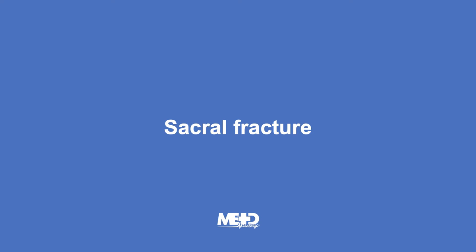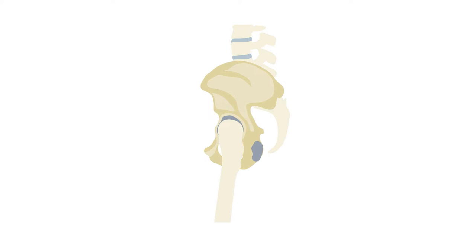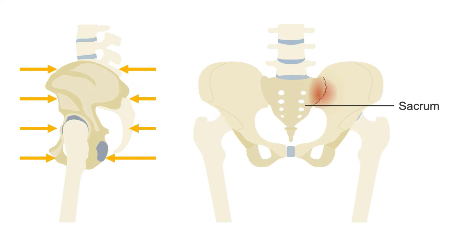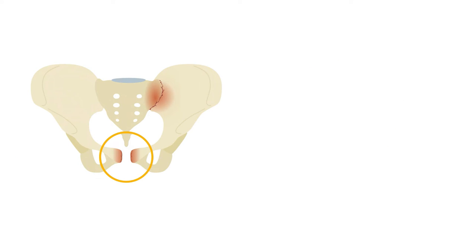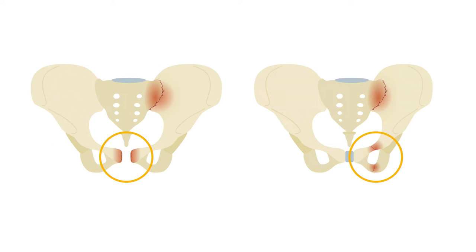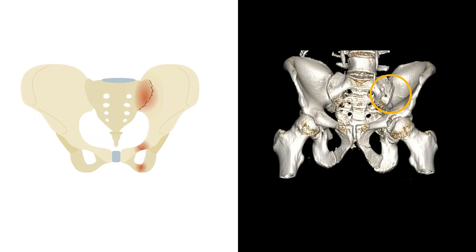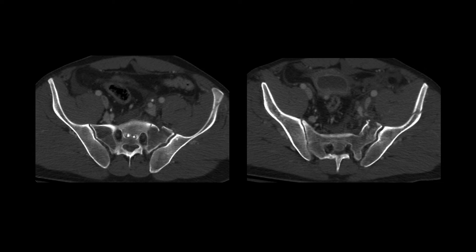Sacral fractures are often associated with injuries to the other pelvic bones. In severe trauma with compressive forces, there can be fractures involving the sacrum and sacroiliac joint, often with either widening of the pubic symphysis or fracture of the pubic ring. Sacral fractures typically follow a vertical orientation along the bone. On CT, sacral fractures will look like irregular lines and cortical defects — abnormal dark lines through the dense outer bone indicating fracture.